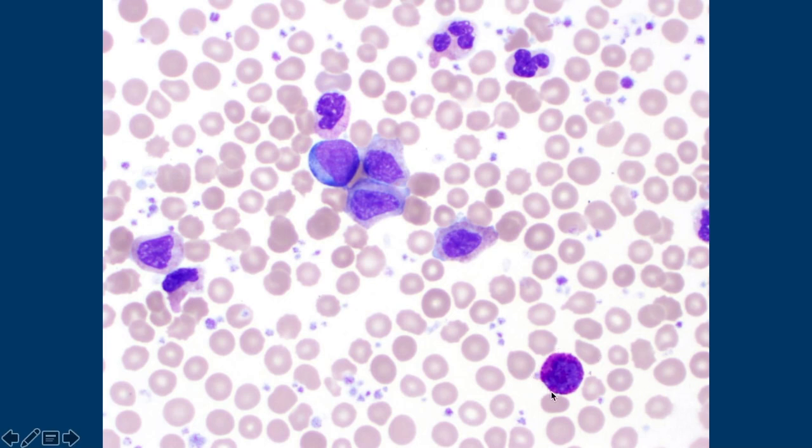So that's a basophil — and that's what a granular basophil looks like. Remember the basophil I showed you before looked a bit degranulated, so that's more of a purple rather than that matte barbie pink. That's probably a neutrophil — I would say seg, because I can see there's a funny fold.